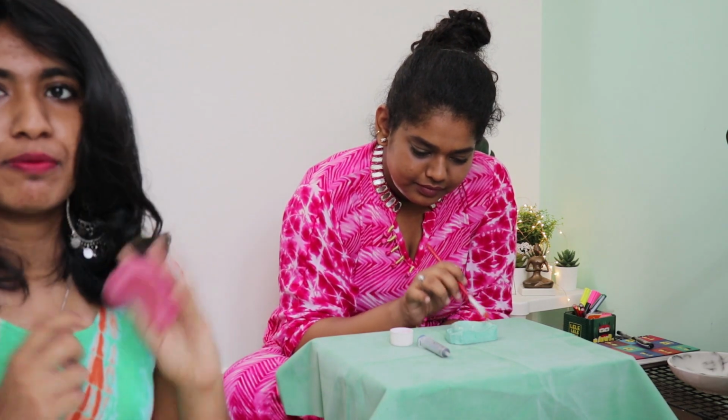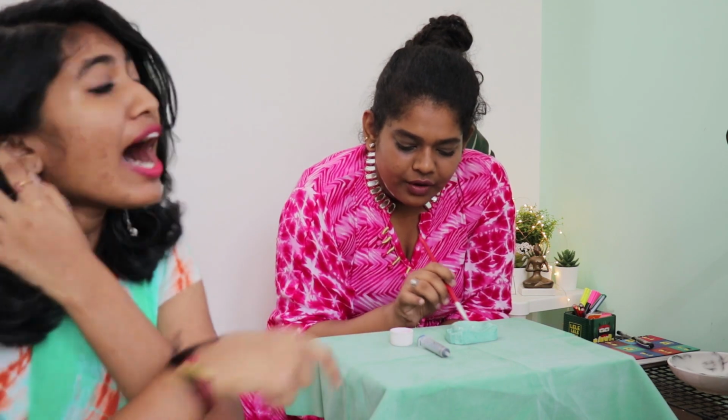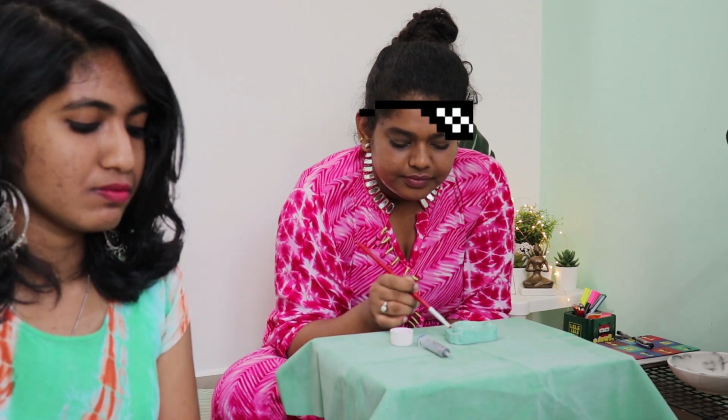I couldn't find this brush. But you're supposed to use a brush and you're supposed to use a thinner brush. Appo da ellathilum pogum. Ana naam vandha adha kaiye padirum.